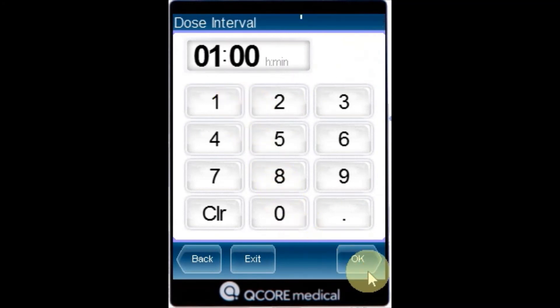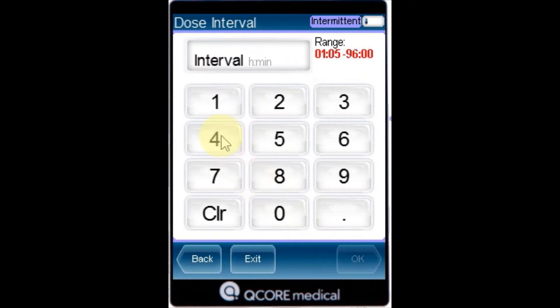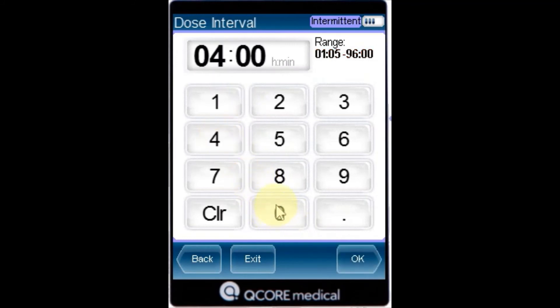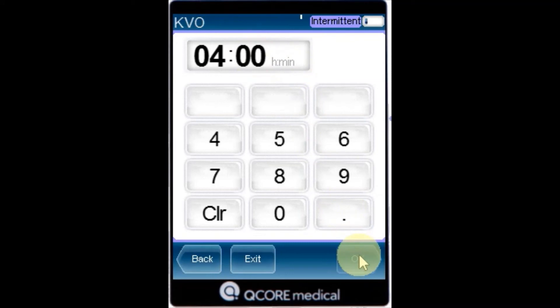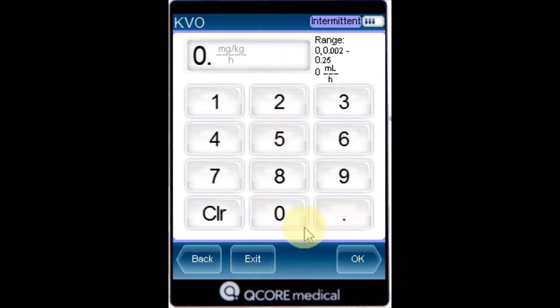Again, using the keypad, enter the dose interval and press OK. And using the keypad, enter the KVO rate and press OK. The KVO rate can be set to zero.